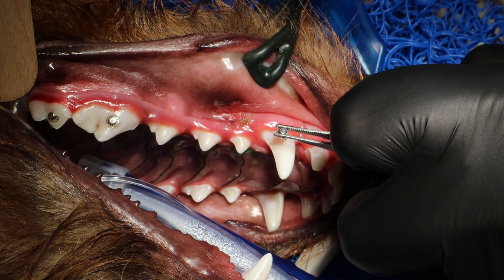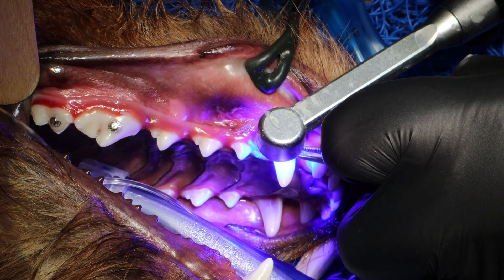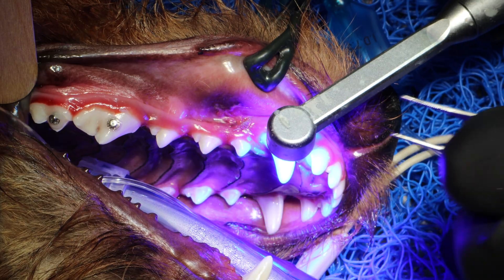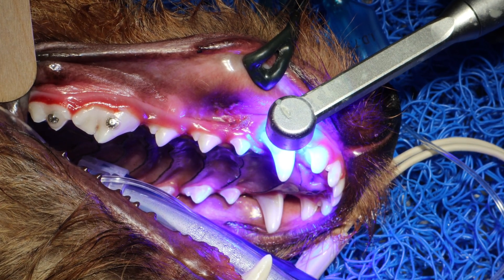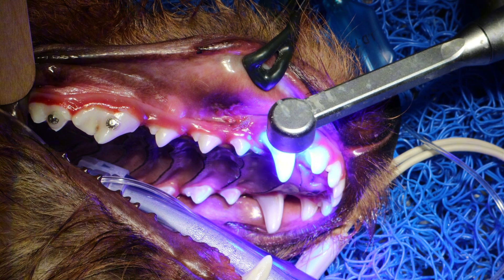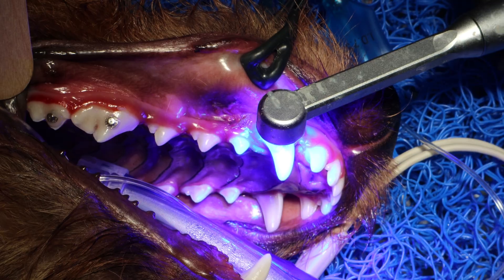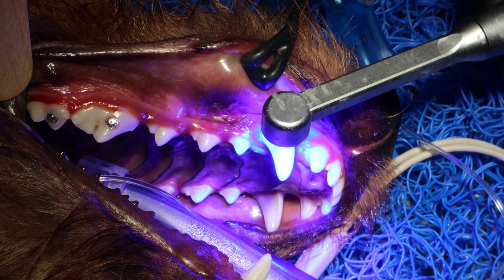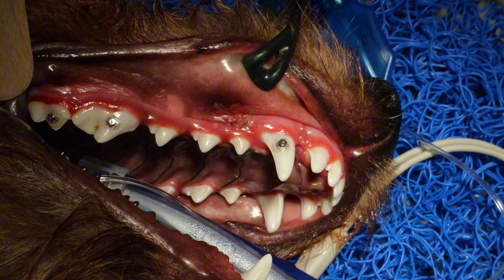The last button is placed on the lateral aspect of that tooth. The further towards the crown tip you place the button, the easier it will tip and the less force you will need. If you place it near the middle between the crown and root, it will tend to induce a translation where the crown and apex both travel in a bodily movement — the whole tooth moves distally. So it all depends on what kind of movement you are aiming for. If I were to critique myself here post-op, I would have placed the button a little lower next time, but it still worked nicely for this dog.